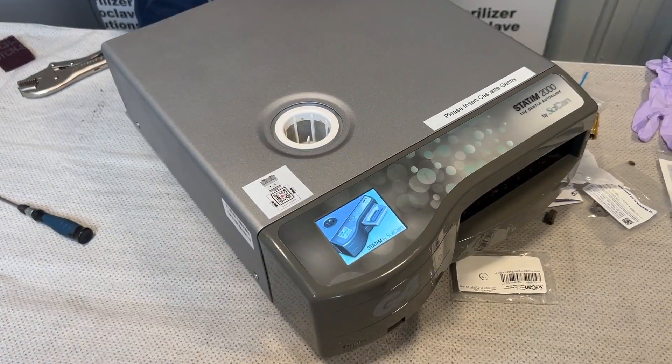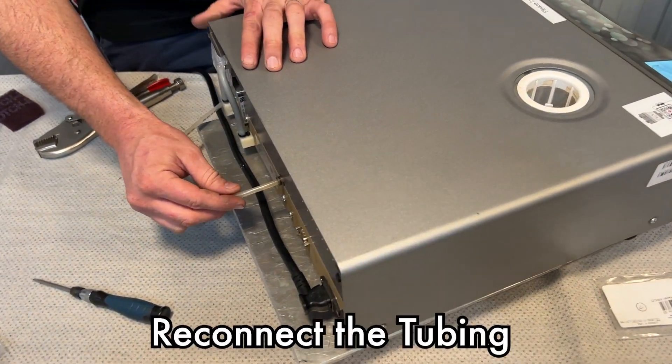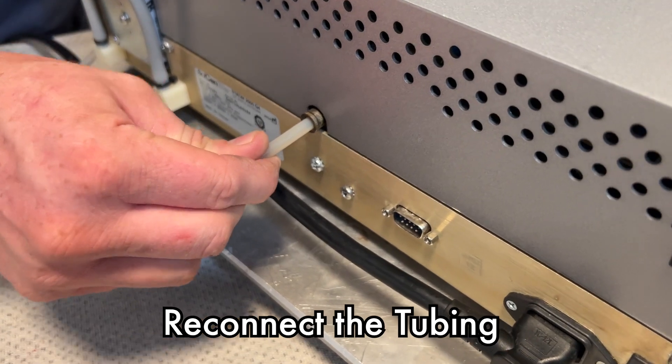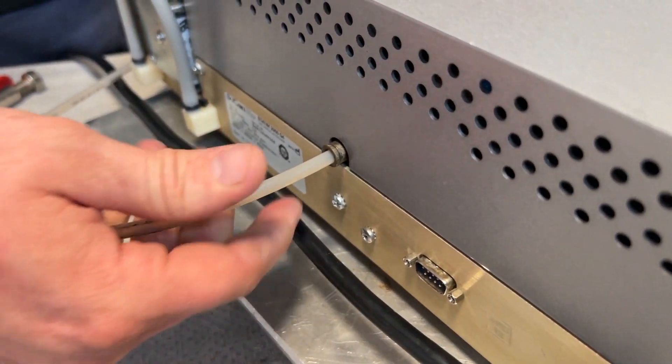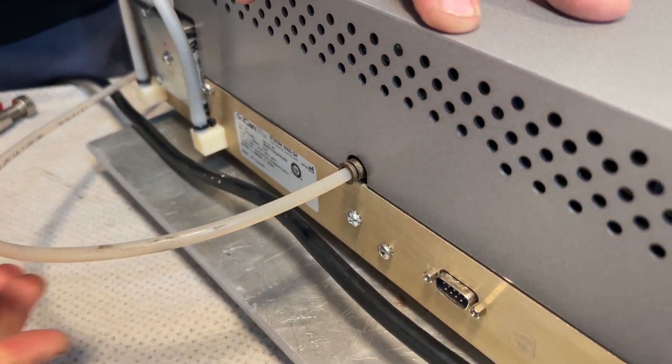I'm going to put my tube back in. That will just push into place, and you should be able to give it a solid pull and it should not pull out.